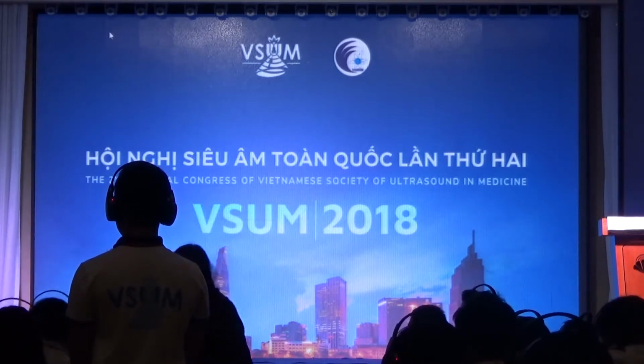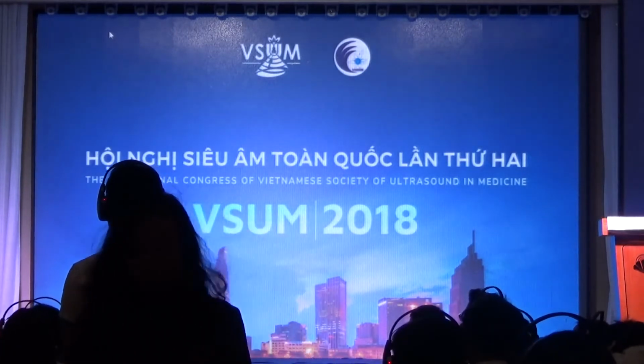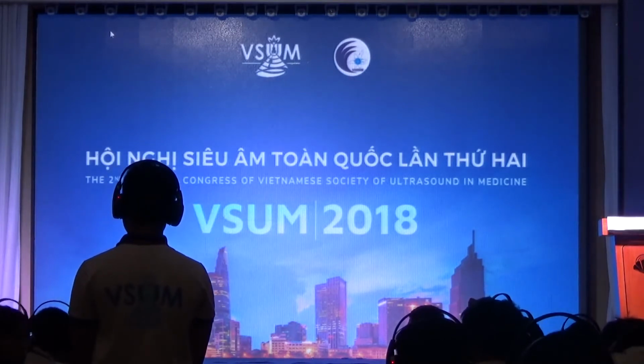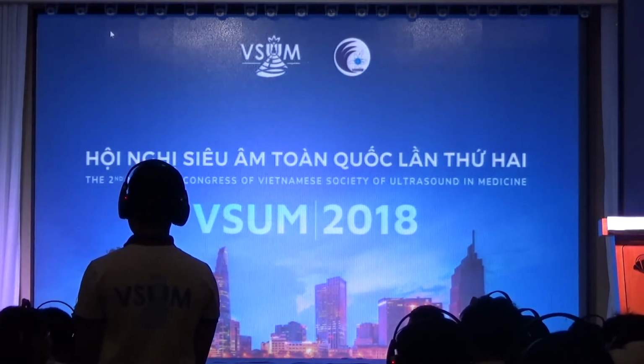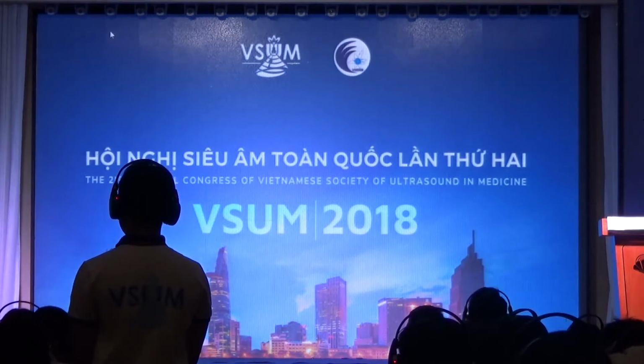So for the SRU, the Society of Radiologists in Ultrasound, which is the American radiology's thing, we don't like to give cutoffs for F0, F1, F2, F3, F4, because in the middle, like Christoph has been saying, we do really well in normals and we do really well in cirrhosis. In the middle, we're not so good at deciding if somebody's F2 or F3. So we give two values.